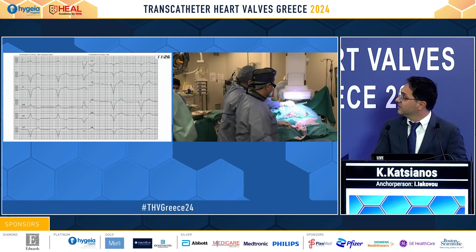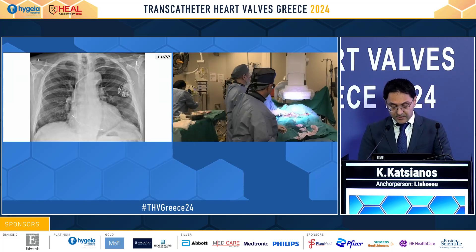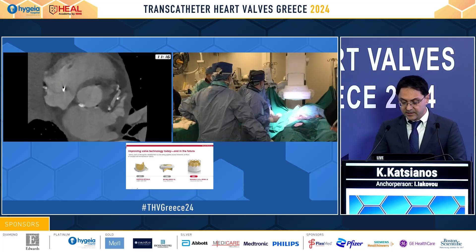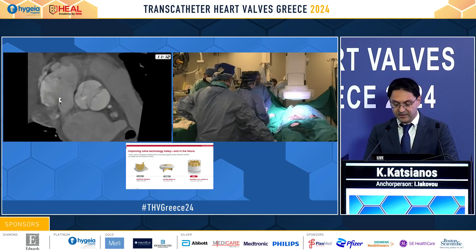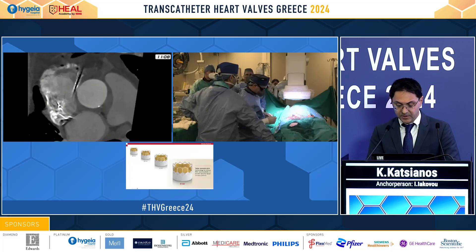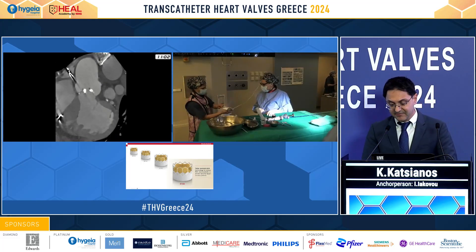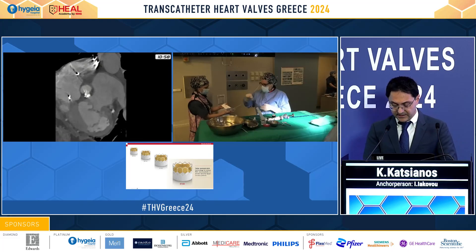Here is the ECG of the patient and the X-ray. We see the pacemaker leads in proper position. On CT, a heavily calcified bicuspid valve, probably of type 0. We also see a calcium region extending toward the mitral valve, which we should take care of.